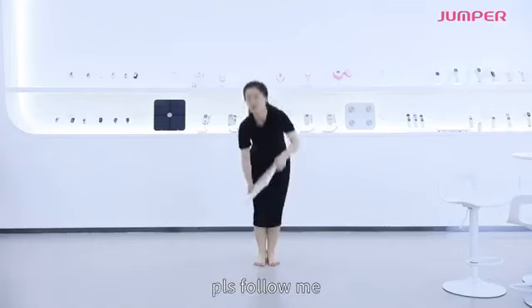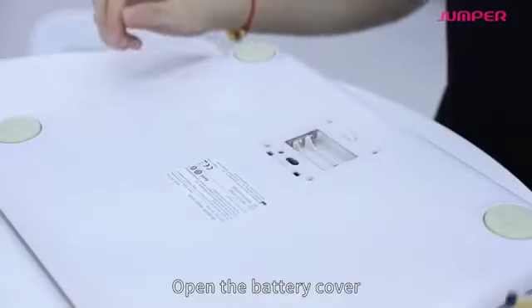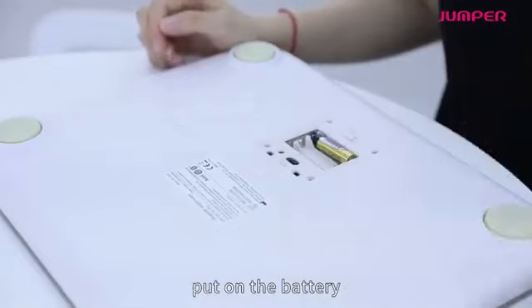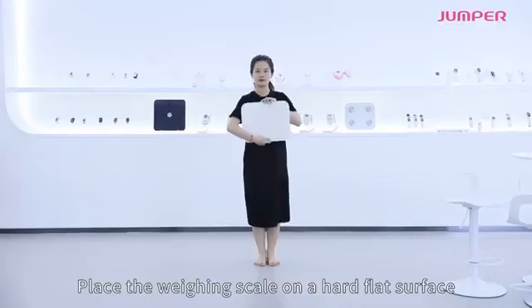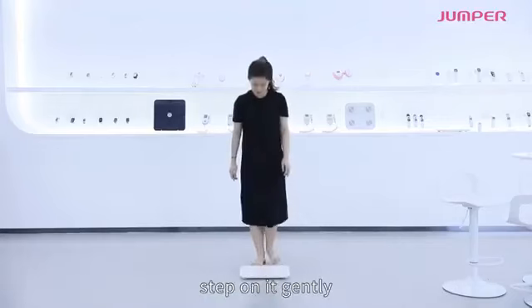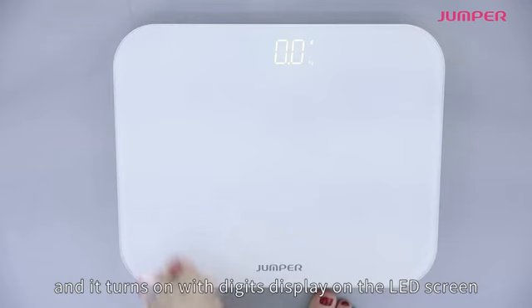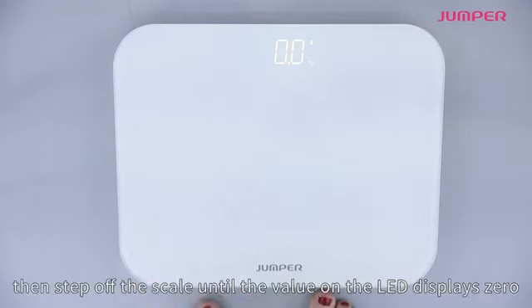How to use it: open the battery cover, put in the battery, and place the weighing scale on a hard flat surface. Step on it gently and it turns on with digits displayed on the LED screen.